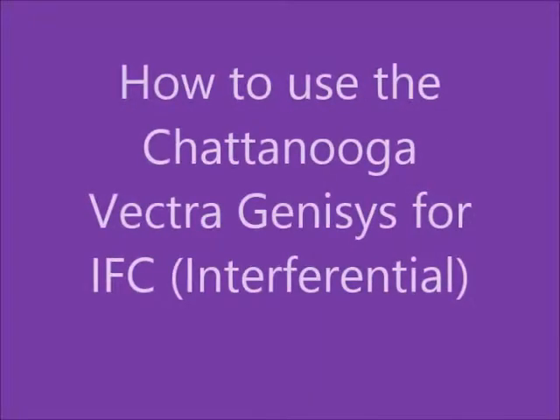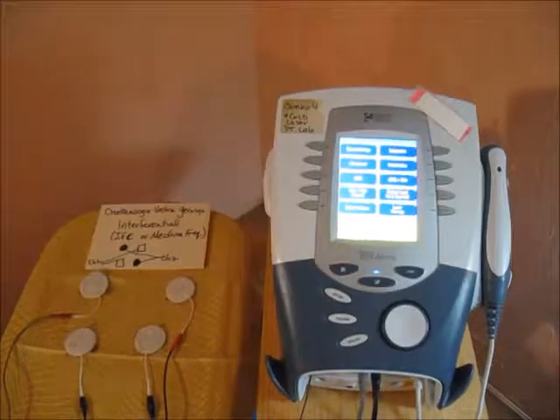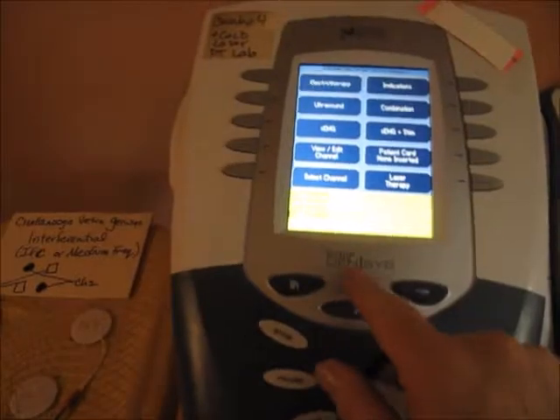How to use the Chattanooga Vectra Genisys for applying Interferential or IFC. We're going to be doing Interferential on the Chattanooga Vectra Genisys.